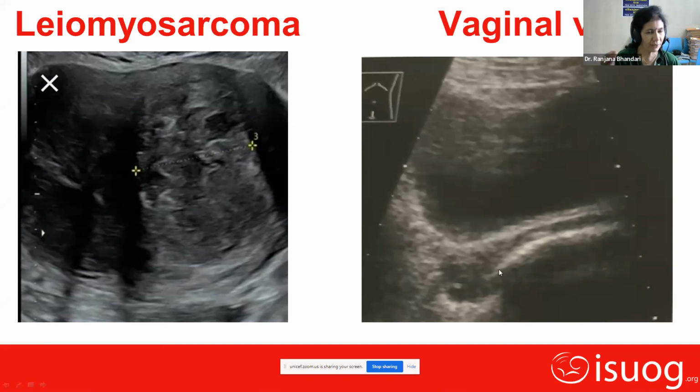And at that time, if we do the ultrasound, we may think it to be a case of some tetra or some gauze lying within the pouch of Douglas or some LIF or RIF. So we should always mention that we have used Adgel in such and such area, of such and such size, so that we will not get confused and we will not open the abdomen again.